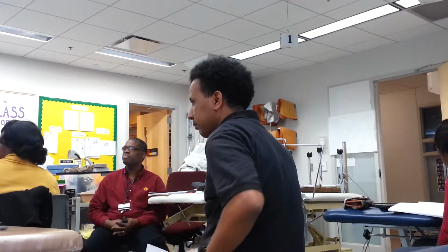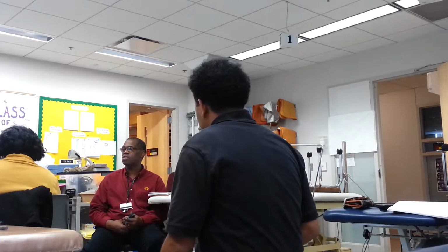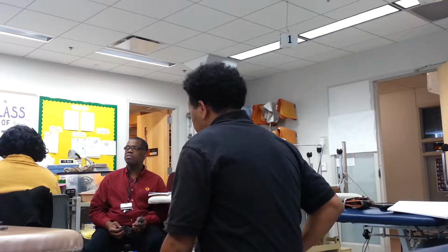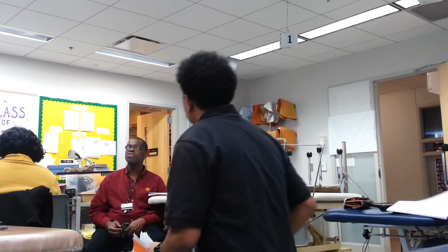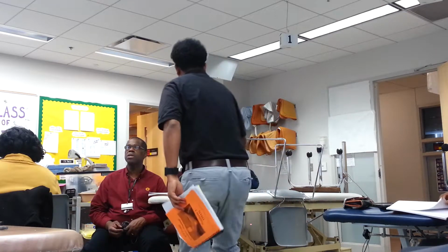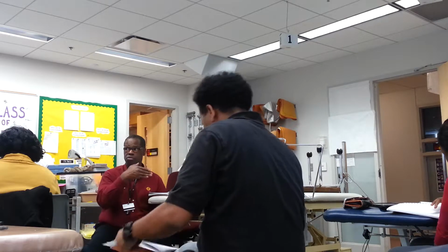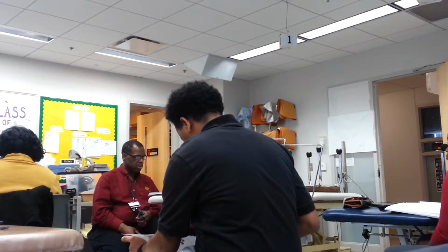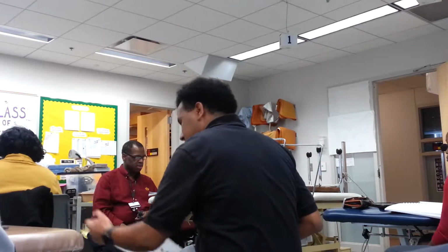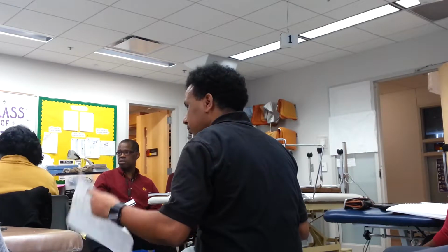The ramp time, as it has to do with reciprocate, slows down the speed of the motion in that direction. Since you're dealing with ramp time for reciprocate, it's controlling the speed of the motion in both directions. Right. All right, then you got on-off time. Good. So for surge, it would just be for the one direction. Yeah.